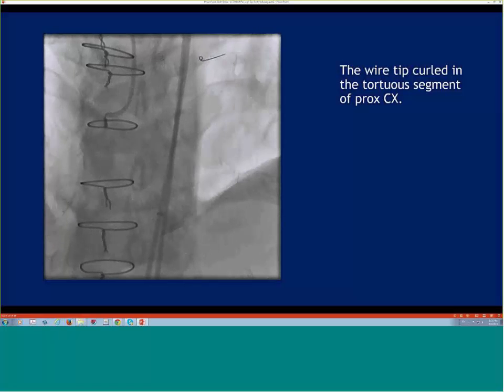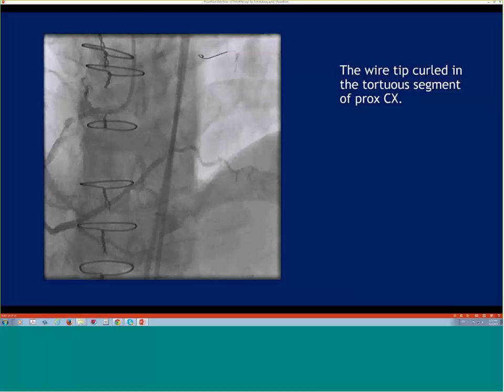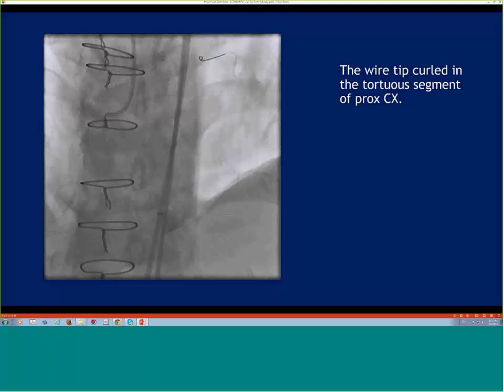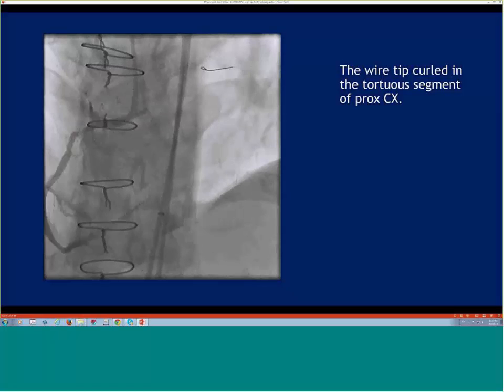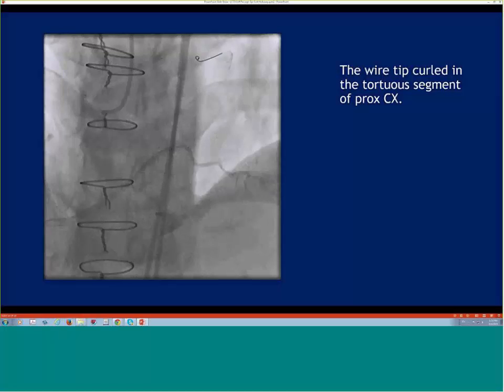Right. I don't do it very often, and the last time I did it was a few years ago, but I've been practicing my coil skills also, because if things go sour, I'm going to have to stop the flow through the epicardial, and that may also compromise the distal. The patient may get ischemic, because that's really the only collateral that I can see to the distal circumflex.